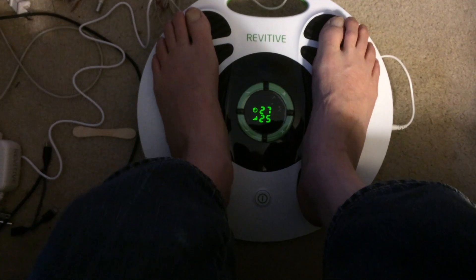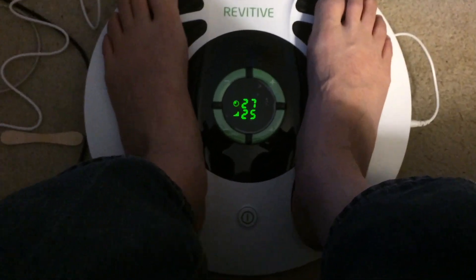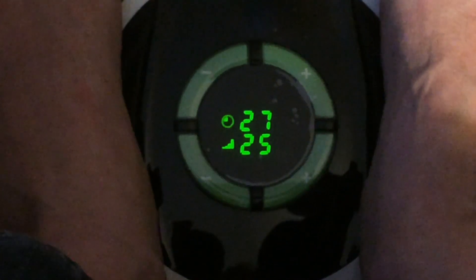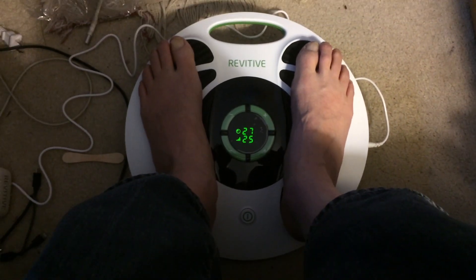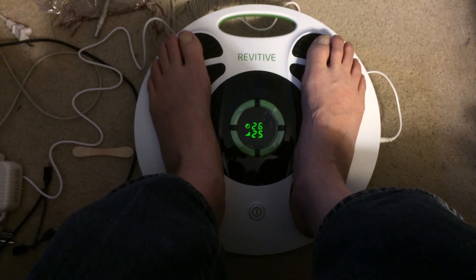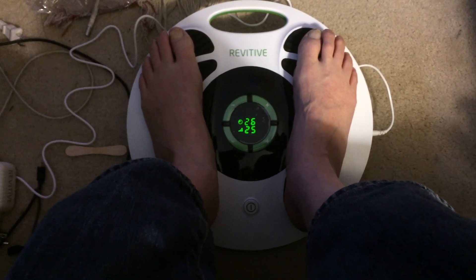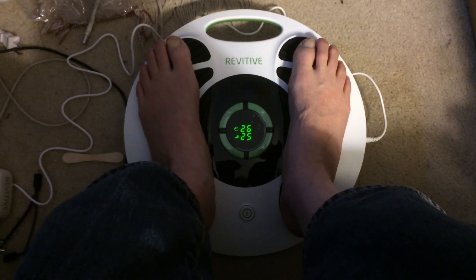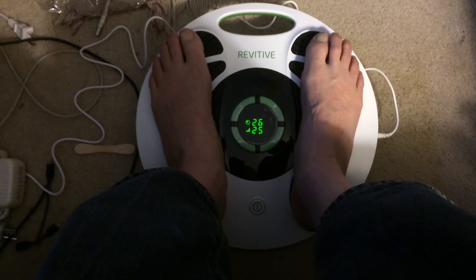So far so good. This is my second 30-minute session. As time goes on I'll add a little more footage to the end of this video to tell you the whole story just in case you might need it. Anyhow, they said I had peripheral neuropathy.